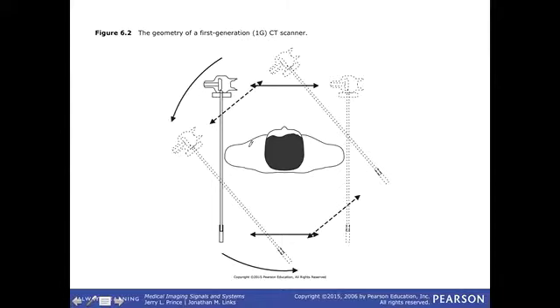And what is the downside of shooting X-rays into a person? So you say radiation. So can somebody expand on that? What happens when you get irradiated? Now you don't get all this stuff. Okay. Ain't it fun? So if you get high energy photons, high energy X-rays coming into your body, and they get stopped by your body, well, what happened there? Energy got deposited in your body, right?